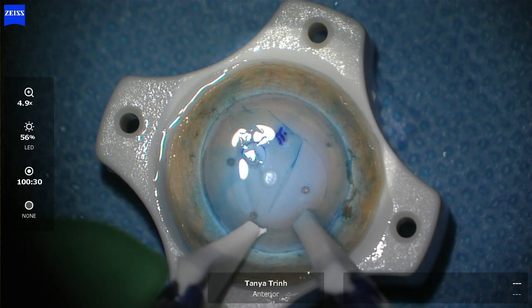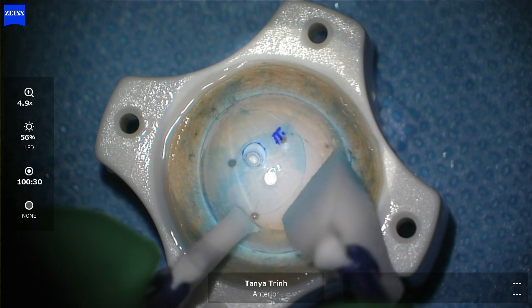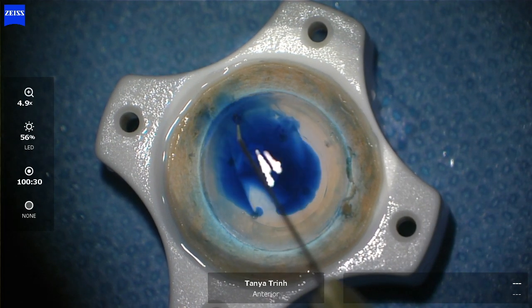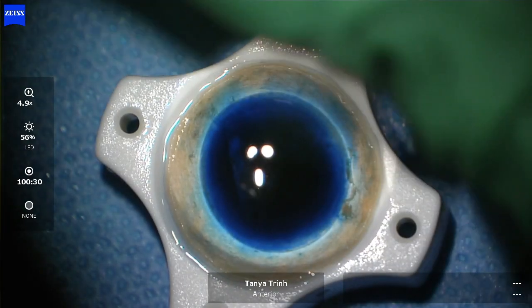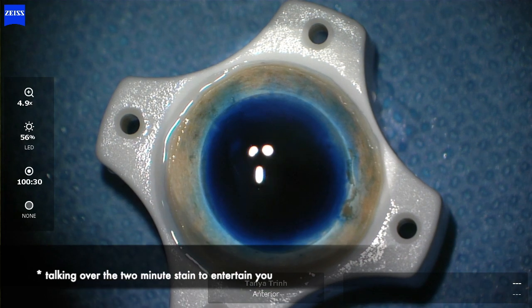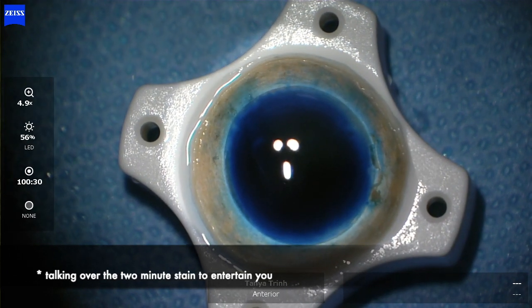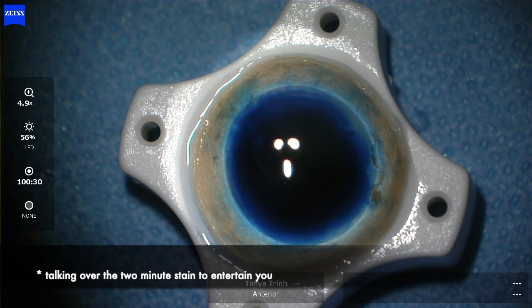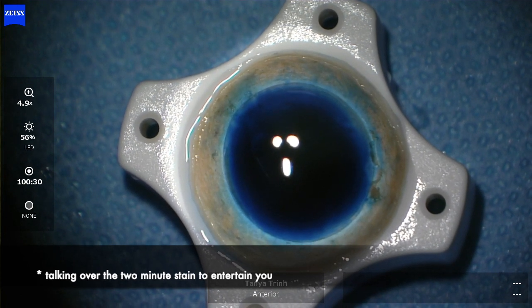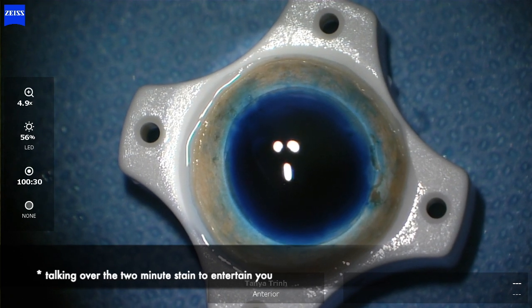Usually I would use the spears in the radial configuration, but as this tissue is quite flaccid I'm not needing to orientate that too much. In fact, in this case it appears to be a little bit adherent to the base by surface tension. At this point I'm adding just enough Vision Blue to cover the tissue and I wait two minutes to stain. The staining at this step allows you to orientate the tissue in terms of its centration in the eye. If I had a patient with darker eyes, or where visibility might be further compromised by a scar or a longer case, then I will stain for an additional minute, because as the tissue moves around inside the eye it can lose its stain and centration becomes more challenging.